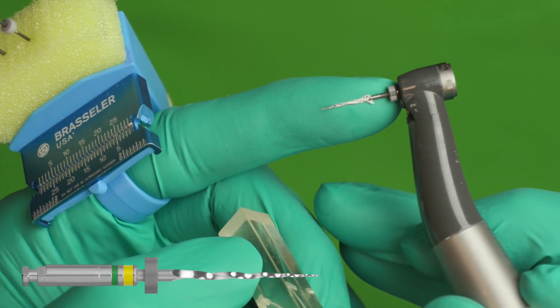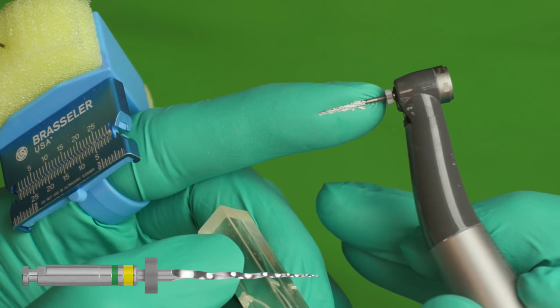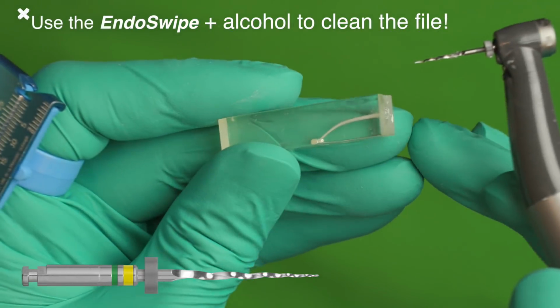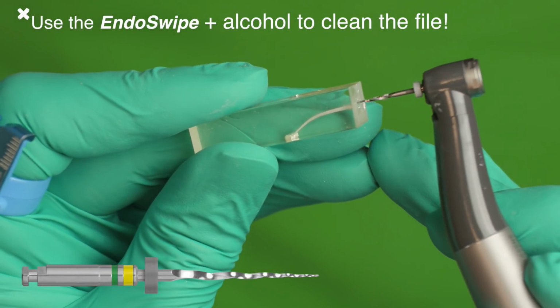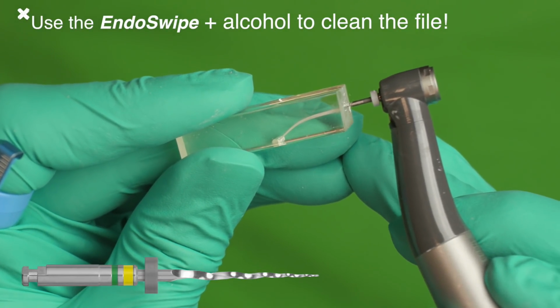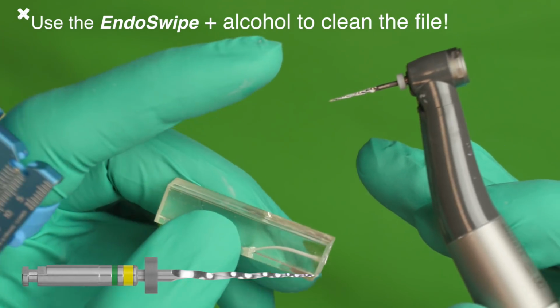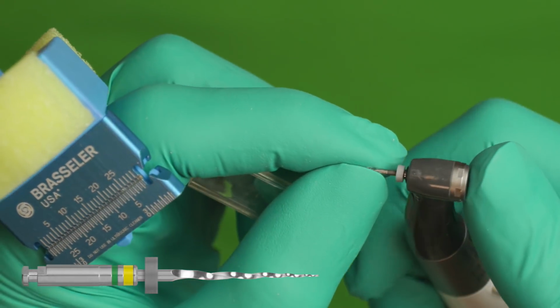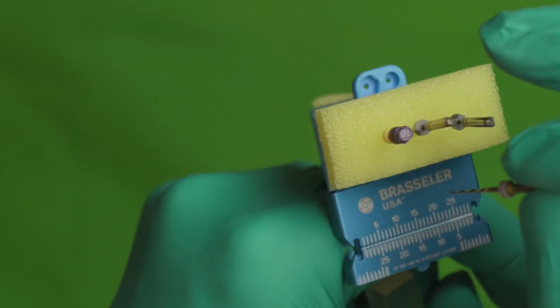You can see with 3 light motions the chip space of the orifice opener is full. So we're going to basically clean that out and then continue with 3 more. 1, 2, 3. And keep in mind that clinically you may only use 1 rhythm motion with the orifice opener if you have a very tight canal.